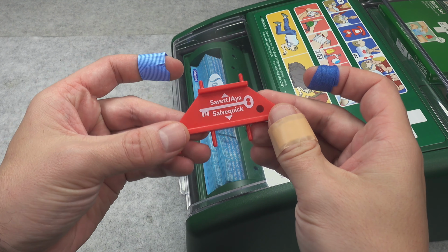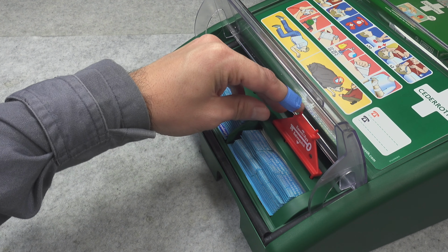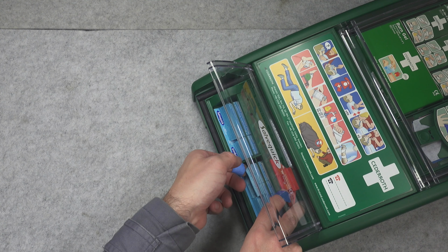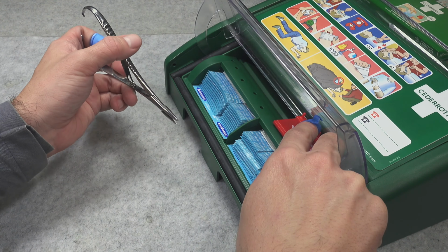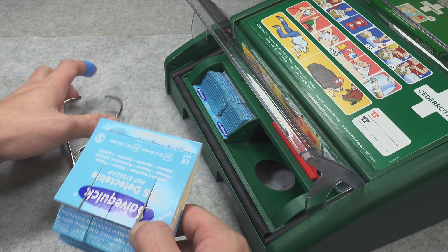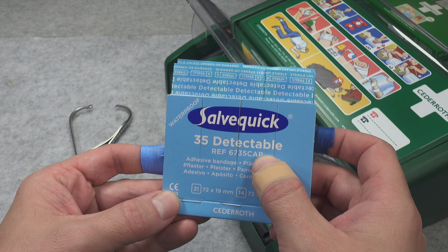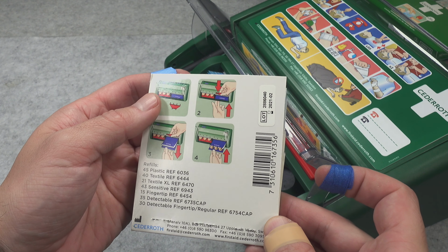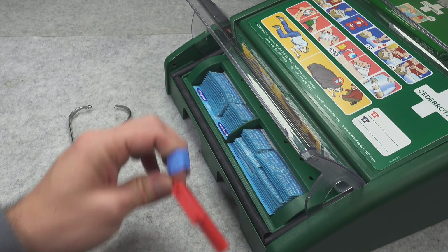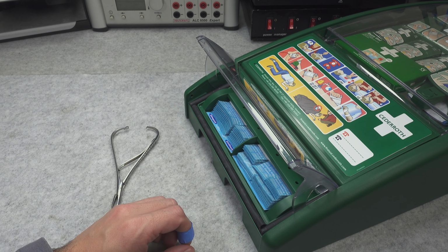And to do it, you need this key. And this key you need to stick here, just like that. And this allows you to pull this whole, let me grab it by something. You press this, you can now grab that cardboard and you can remove it. And here you can see the information and what the model is. As you can see, nice, waterproof. Just take a look. And if you would like to put it back, you just stuff it like this. And now no one can remove it without the key, so no one is going to be stealing it.